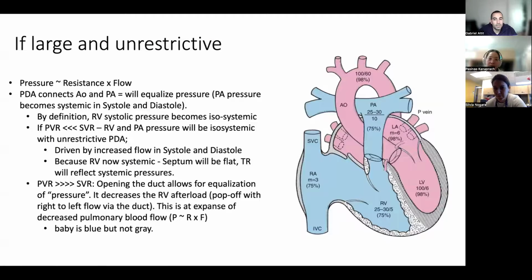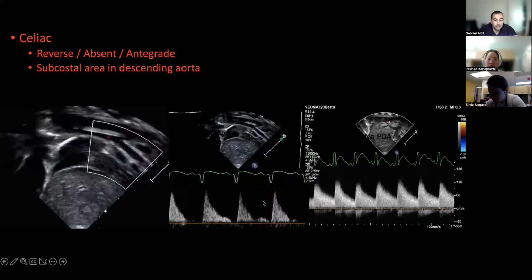So you would expect between 25-30 of systolic, and these values are true for babies that are 3 months old and older and that are born at term. We actually don't really know what the normal transition is for other conditions, but we assume and we do think, based on all of these other observational studies, that these babies should reach these values at around the term corrected age when they're born premature.